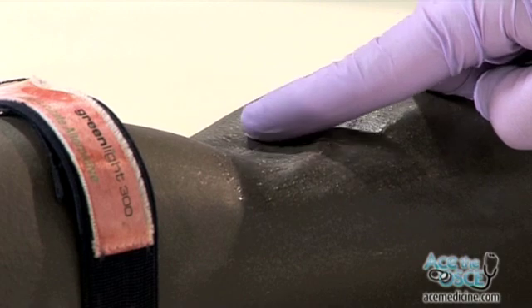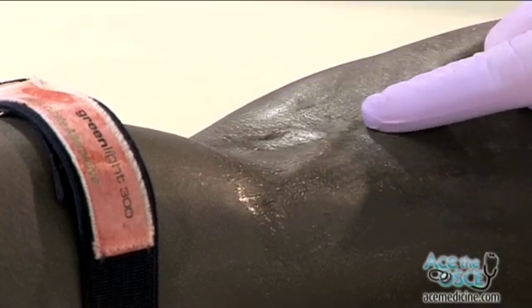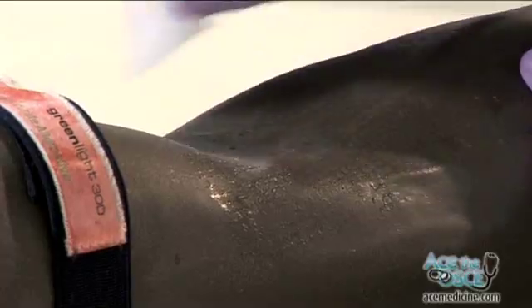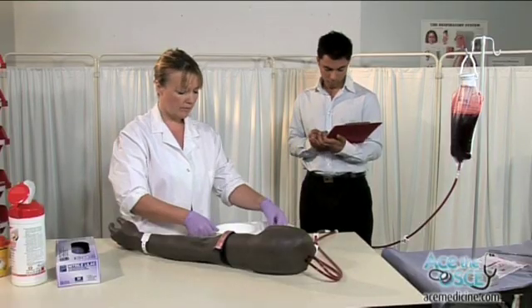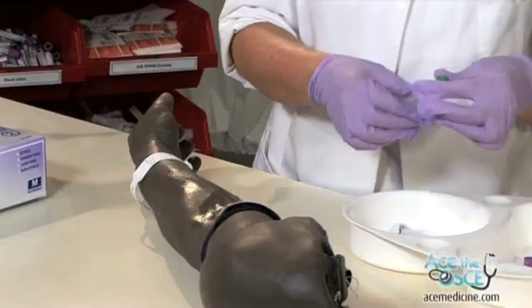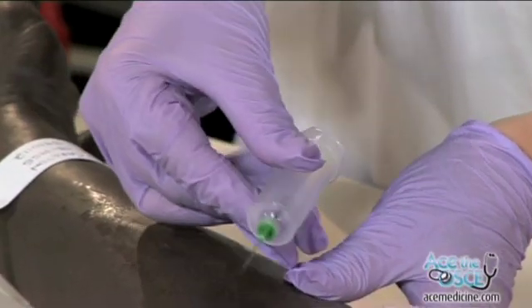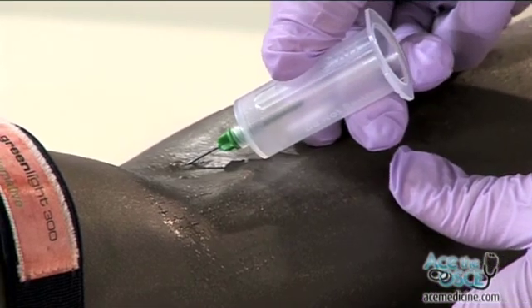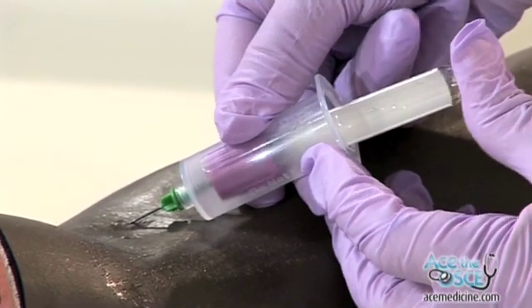Find a suitable vein. Cleanse the skin using an alcohol swab. Remove the cap from the needle and warn the patient of a sharp scratch. Sharp scratch, sir.